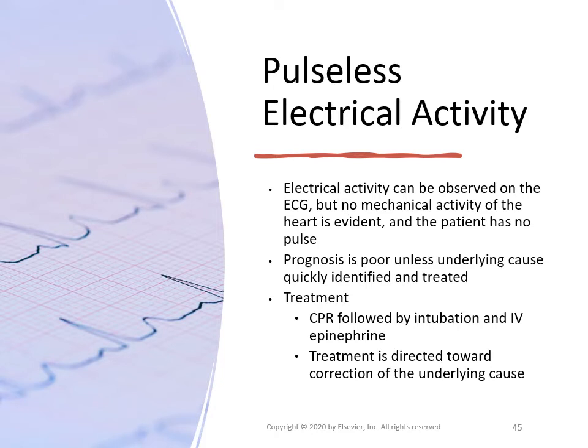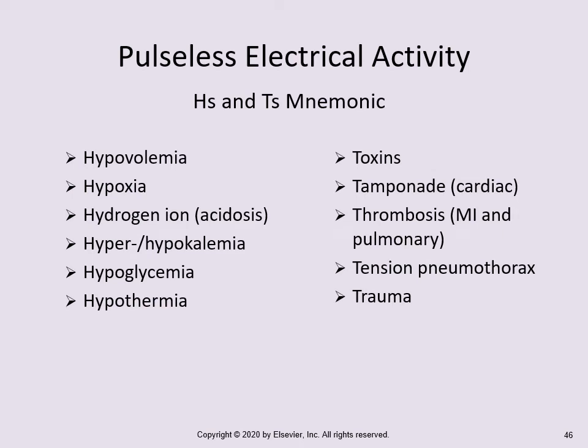It appears there is electrical activity going on in the heart with no mechanical activity to accompany that. The prognosis is very poor unless the underlying cause is identified and treated immediately. Once again, CPR is initiated and further treatment is directed specifically at the cause. This slide shows the cause.